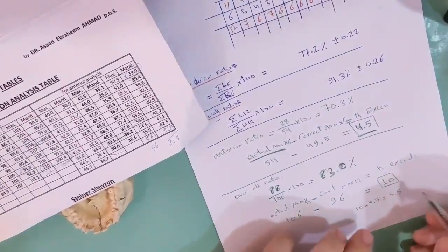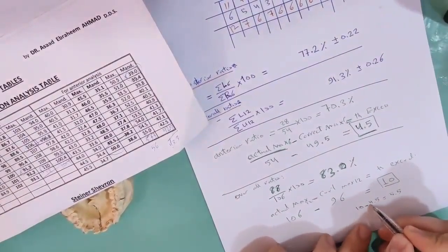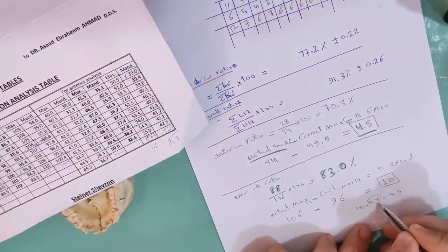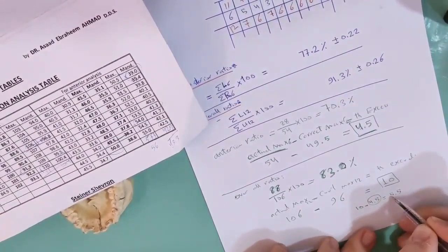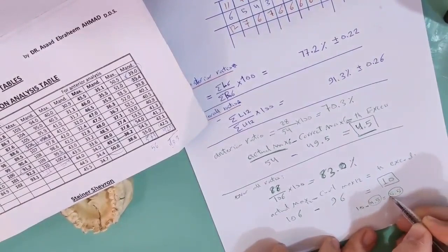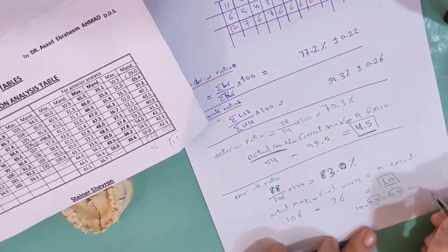So in the maxillary teeth, we have an excess volume of about 4.5 in the anterior teeth, and 5.5 millimeters in the posterior teeth for both sides.